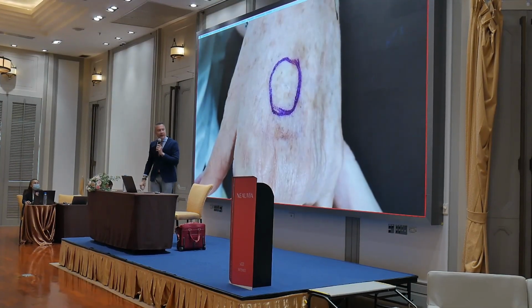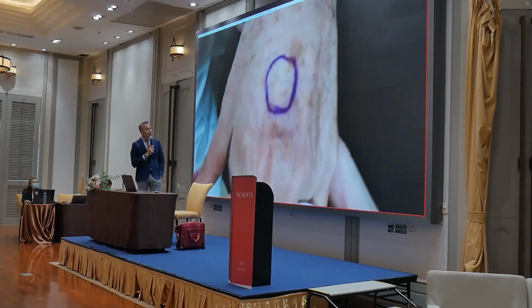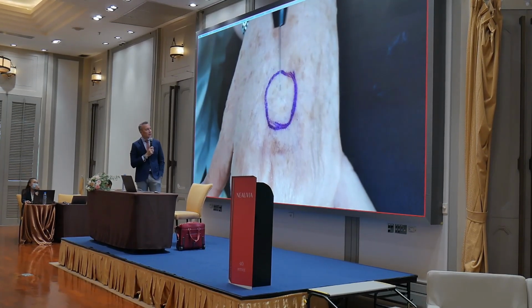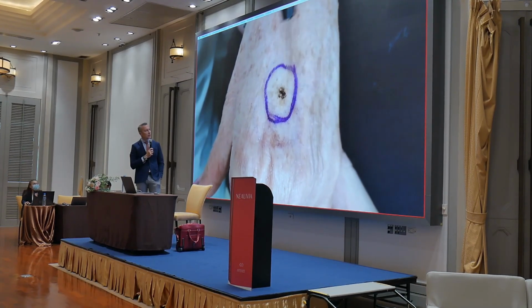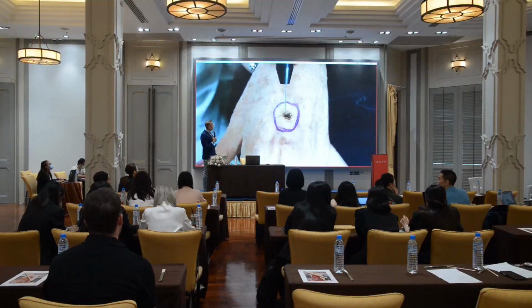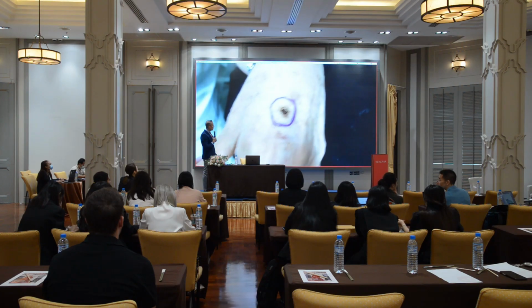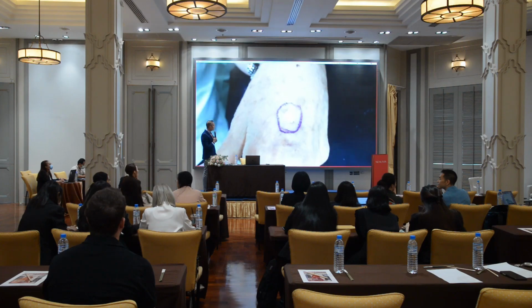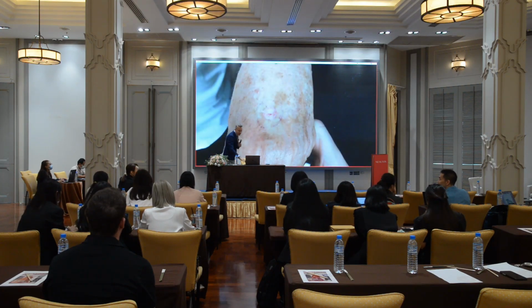This is a seborrheic keratosis at the early stage. So here you go with the high settings. You do it almost continuous. And you see that you are very superficial. Then, with the gauze, you can remove the pigmentation. But it's very superficial. It's pretty superficial.